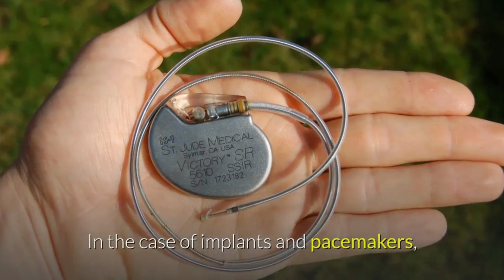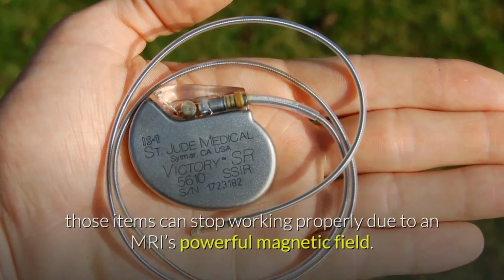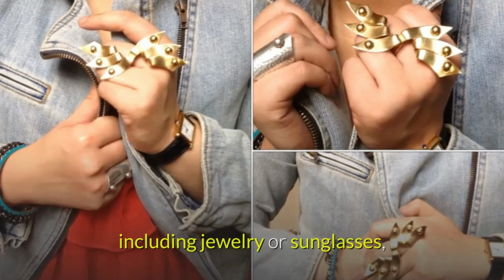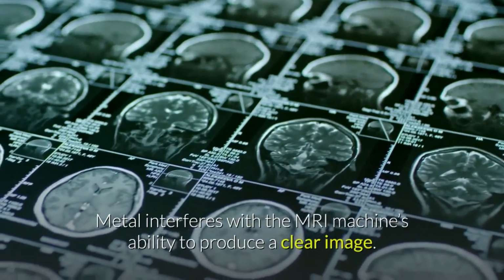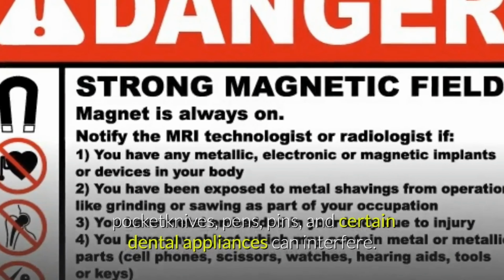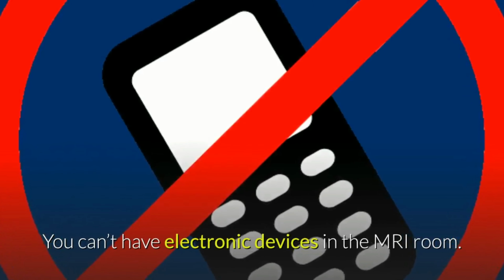In the case of implants and pacemakers, those items can stop working properly due to an MRI's powerful magnetic field. If you're wearing anything that contains metal, including jewelry or sunglasses, you will need to remove those items. Metal interferes with the MRI machine's ability to produce a clear image. Pocket knives, pens, pins, and certain dental appliances can interfere. You can't have electronic devices in the MRI room.